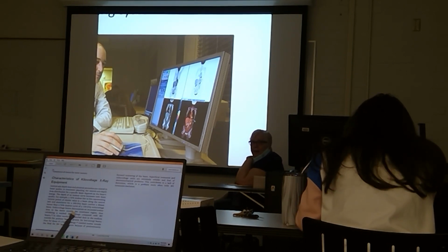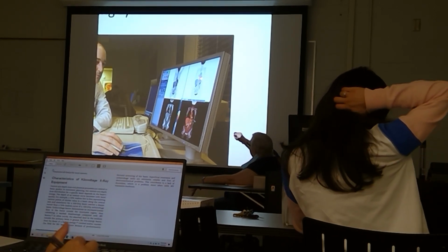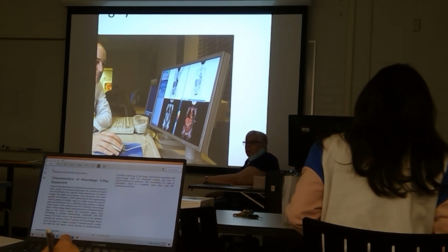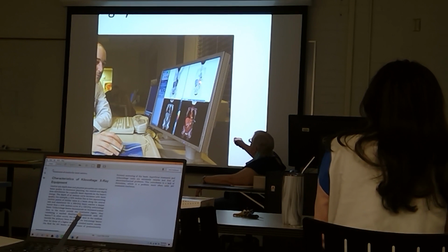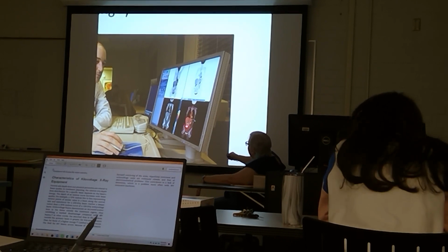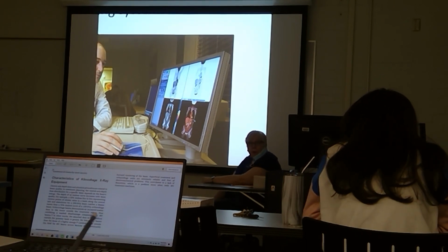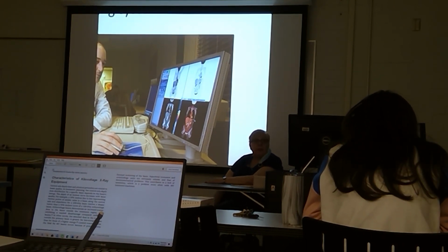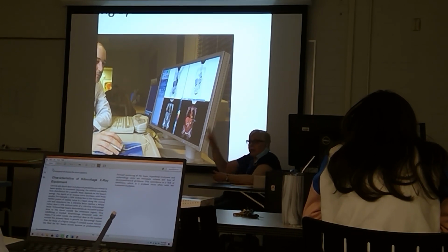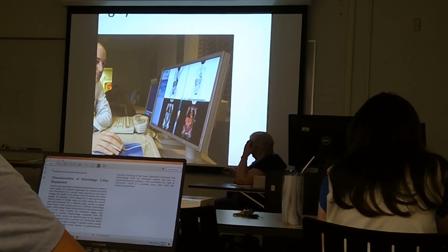So anything that's black in a PET scan or high color, like here for example, is bad. It usually shows cancer. So here, here, and here, and a little bit here. The bladder, we don't worry about. Why? Filtration. It filters out. Yeah, basically that's where the excess is removed.